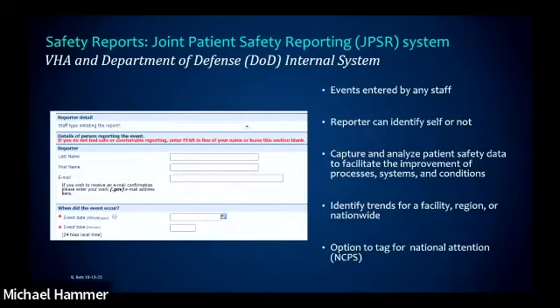So this is what it looks like in the VA where I work with our veterans here in the United States. We have an internal system as well. We report in both places. So if there's an issue that needs to be reported, with a medical device concern, we also have an internal system. We share it with the DoD, which is our Department of Defense. And basically, any individual working in our healthcare system has the opportunity to report an adverse event. They can identify themselves or not.